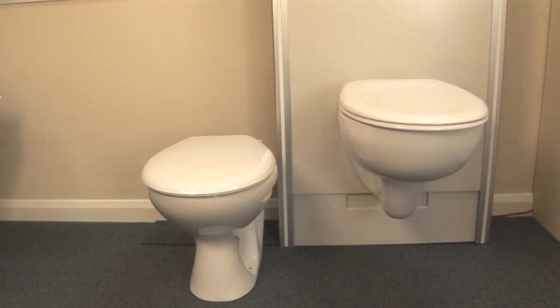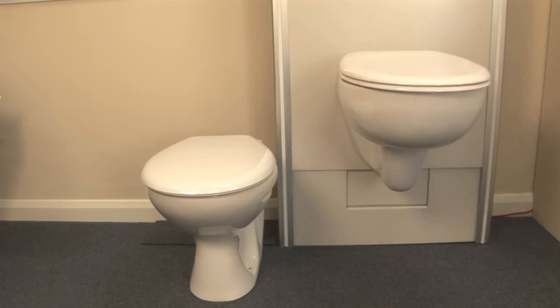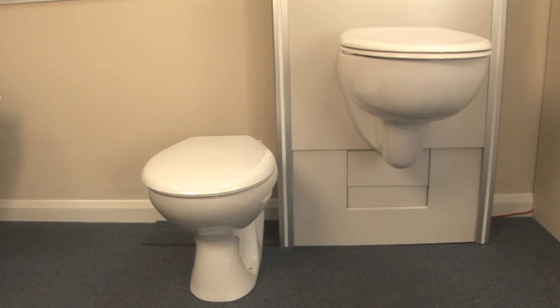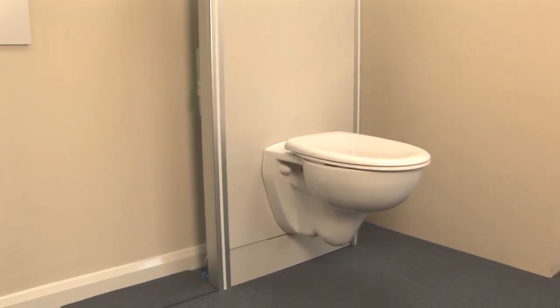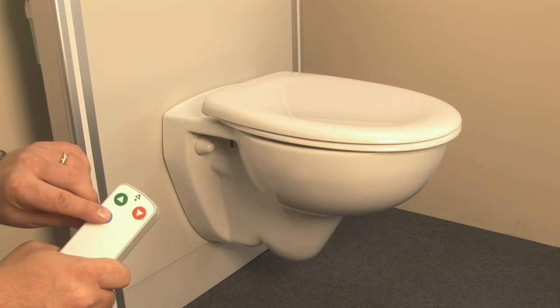SaniMatic has a height adjustability of 37cm, from a minimum of 380mm to a maximum of 750mm from floor level. It is designed to carry a load of up to 150kg, and the unit comes complete with a 6L cistern that can be flushed by pressing the blue button on the control panel.